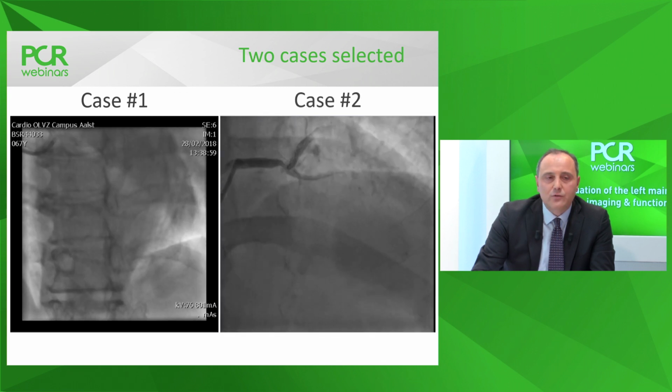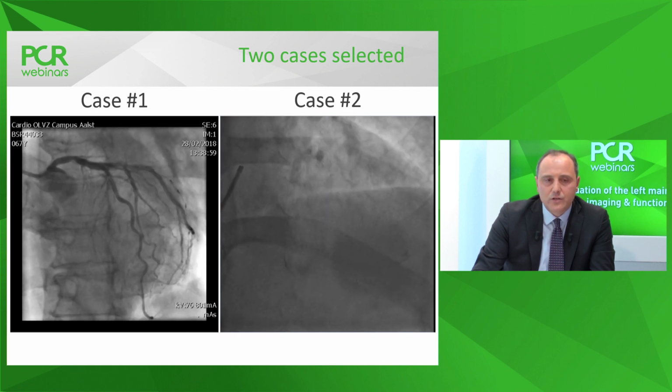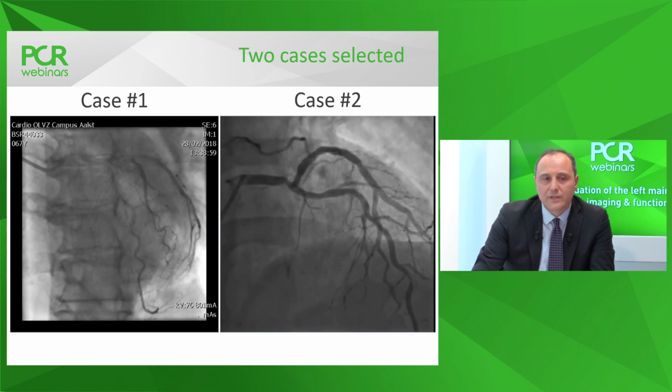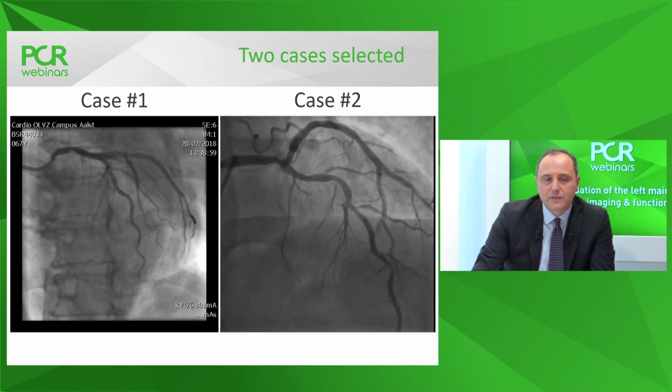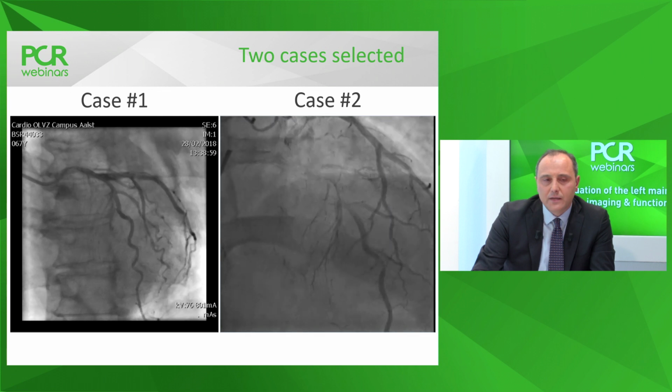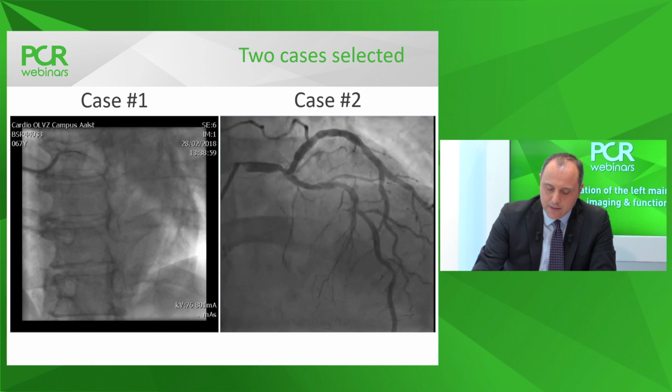On the right side, you see the second case that was performed in San Raffaele Hospital in Milan, which is, from an anatomical point of view, a little bit more complex than the previous one, as beyond the distal left main disease, there are also two sequential stenosis in the mid-LAD segment.